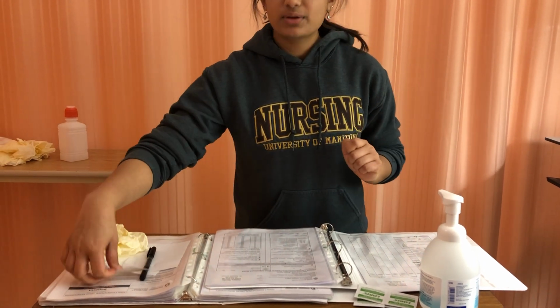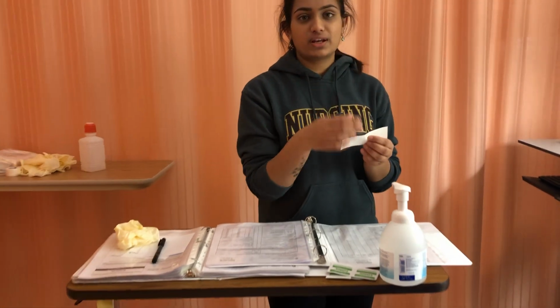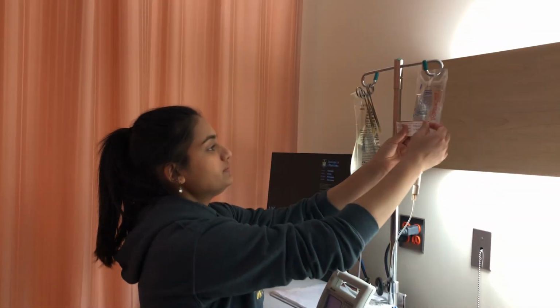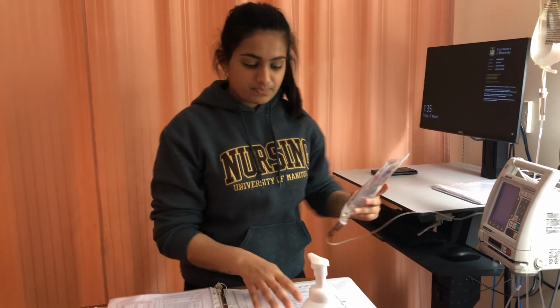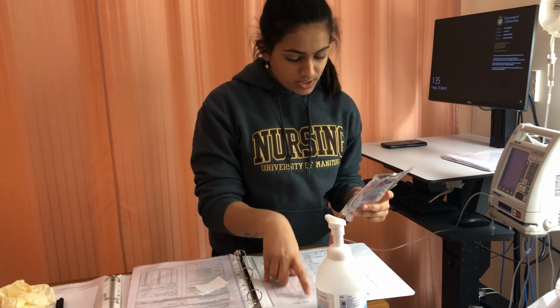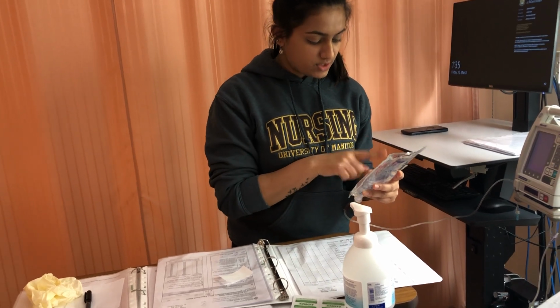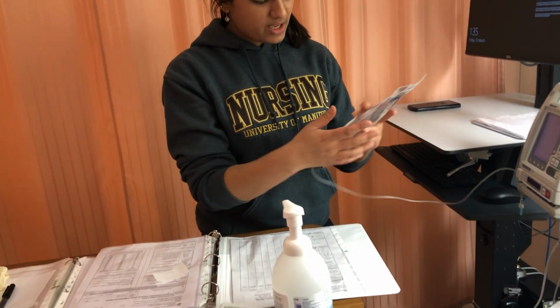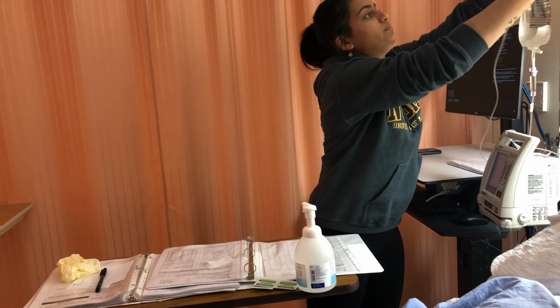So I'm just going to look at the bag, and I have prepared a label for the bag just because I want to know which rate it's going to be going at, so I'm going to put the label on the bag here. Alright, so I'm just going to take this, I'm going to compare it to my MAR now. So this is still part of my first check. So it's for Wendy Holmes, it's heparin, the dose is 1350 units per hour, which will be 13.5 milliliters per hour. I'm also checking the bag, it's intact, it's not expired. And it's scheduled for now, and it's going to be given IV continuous. So I'm just going to put this here for now.